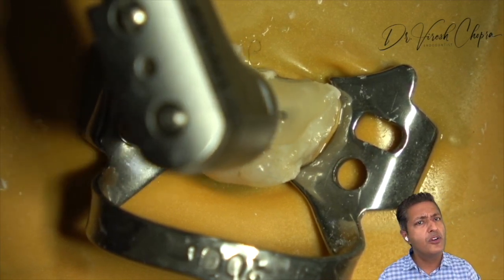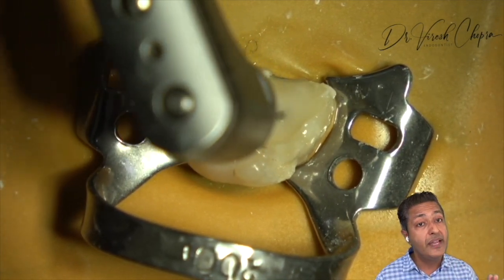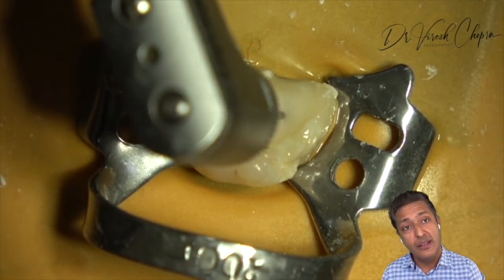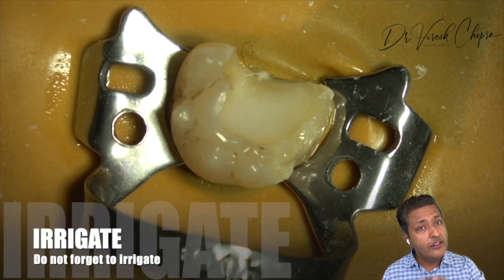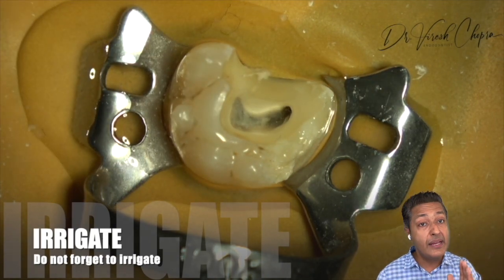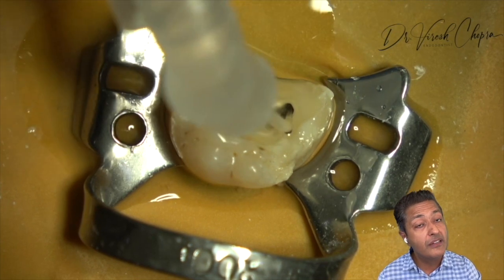Once we confirm the orifices, if we are not using any rotary system, then we need to widen the orifice by using Gates Glidden drill, as you can see on your screen. But we have to be gentle. Place the Gates Glidden drill on the orifice and just rotate in a circular motion so that we widen it. Do not do any outside to inside motion. What we have to do is maintain the motion from inside to outside.